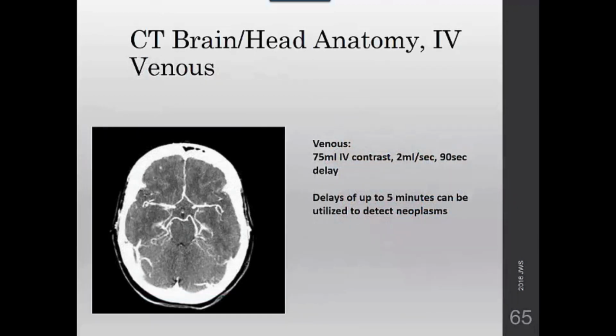Imaging of the brain, the head with IV contrast, and then we'll talk about CTA of the central vessels of the head.